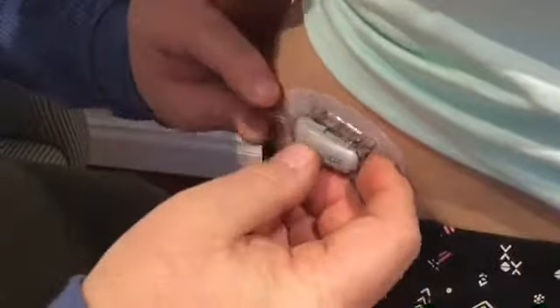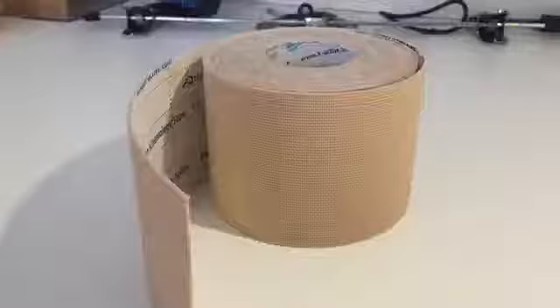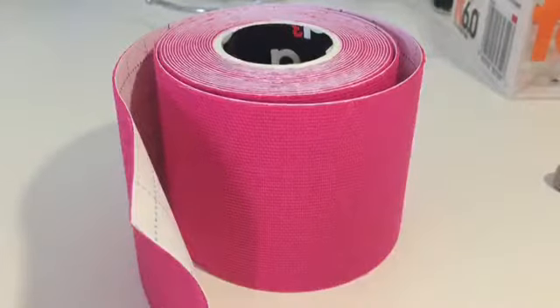Put the sensor in the pod and use this little thing here to push it in. It may take some force but you'll get there. This is how it should look in the end. You can use sports tape to make sure that it stays in place.